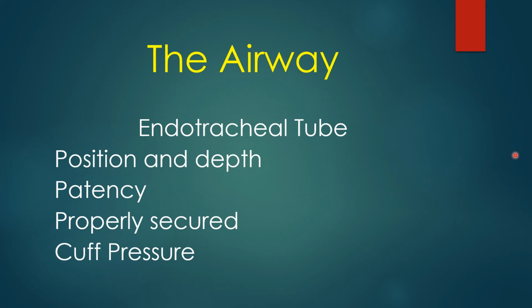It can go down, and if it goes down, it tends to go down into the right main stem, and that causes serious problems. So we want to document that the position is on the right side of his mouth, and it is 23 at the teeth, not at the lip. You'll see some people chart it that the ET tube is 23 at the lip. The lips swell and move, and that's not as consistent as at the teeth, because the teeth stay where they are.